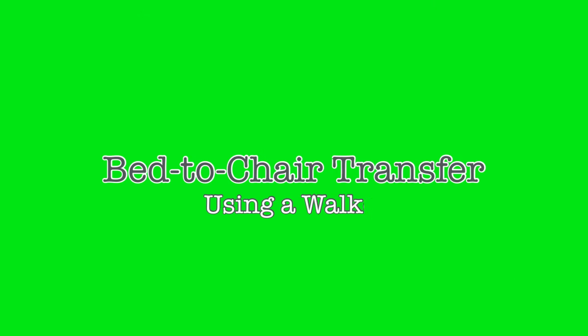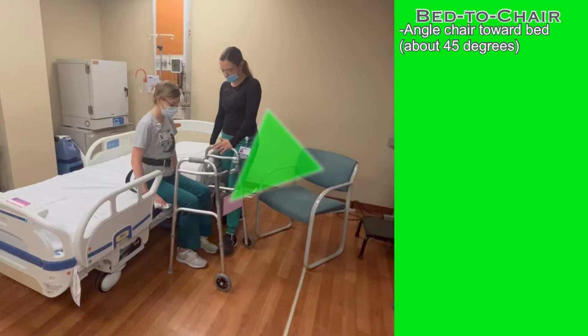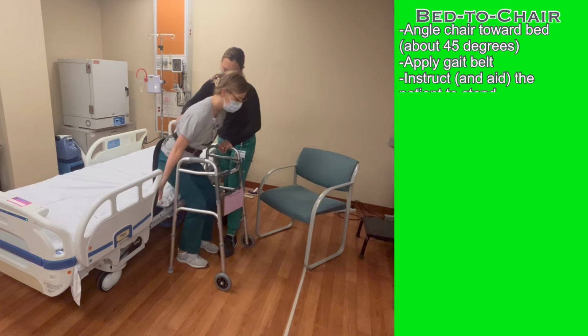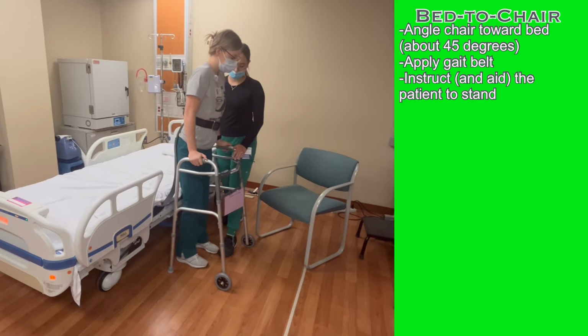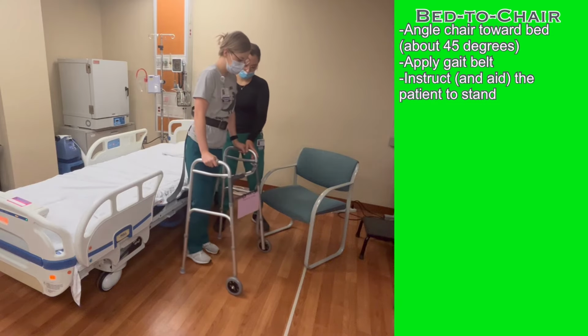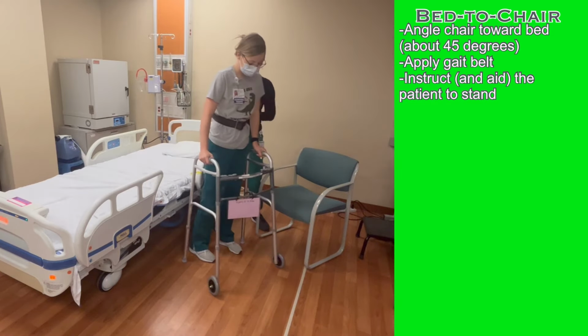To help the patient that requires minimum assistance safely transfer from the bed to the chair, follow these steps. Position the chair angled toward the bed, but far enough away to allow a walker to maneuver between the bed and the chair. Apply a gait belt to the patient, and follow the process previously described to help the patient stand with a walker. The minimum assistance patient can do most of the work on their own. Your job is simply to guide and support.